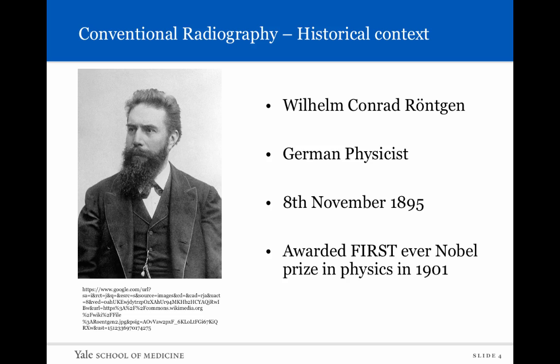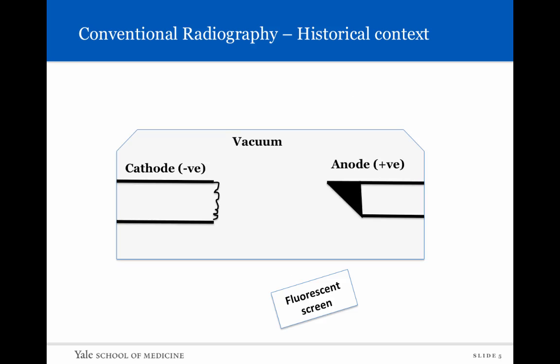So how did this all come about? Well, back in 1895, Röntgen and a whole bunch of physicists were experimenting with something called cathode tubes. The particular one he used was something called a Crookes tube, which is essentially like a large light bulb. Inside of it there was a cathode end, which is connected to the negative portion of a very high voltage power source, and an anode, which is connected to the positive portion of that same power source. When you switch on this power source, a bluish hue would emanate from inside this structure, and those were known as cathode rays.